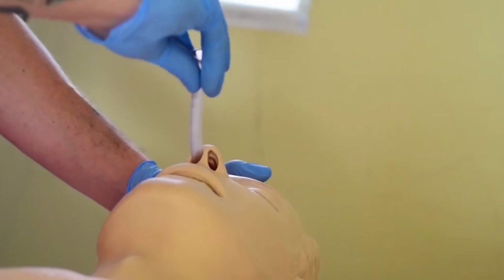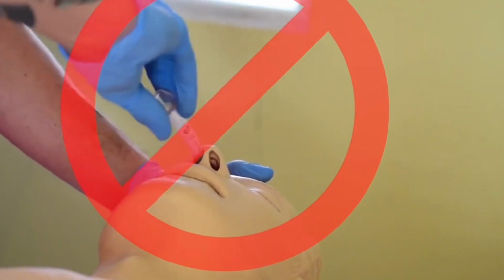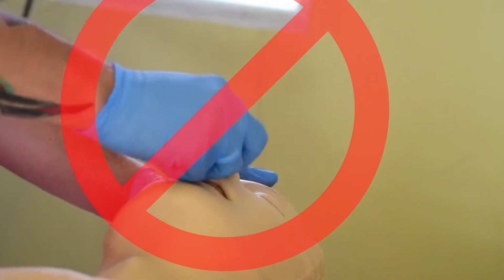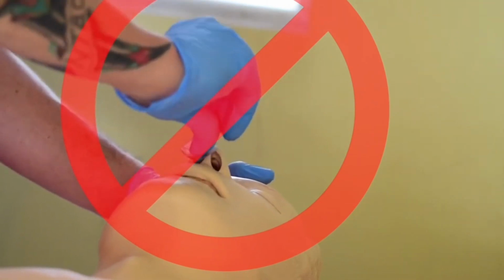At no time should the device be corkscrewed or rotated 360 degrees, as this carries an increased risk of trauma to the nasal wall and the nasal turbinates. A small amount of trauma and bleeding may be evident after insertion. This should be assessed and observed to ensure that no serious injury has occurred.